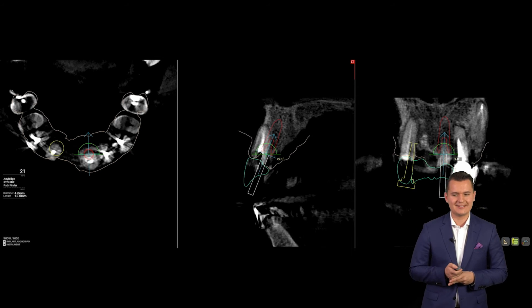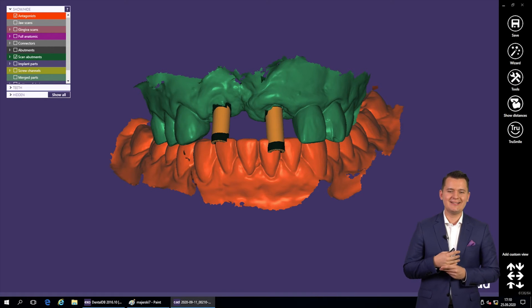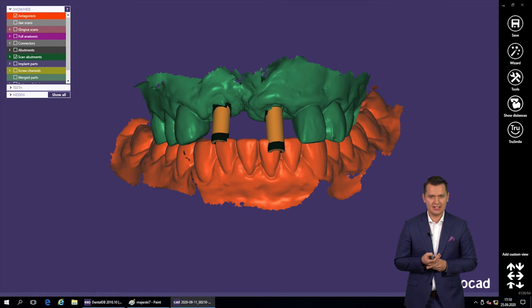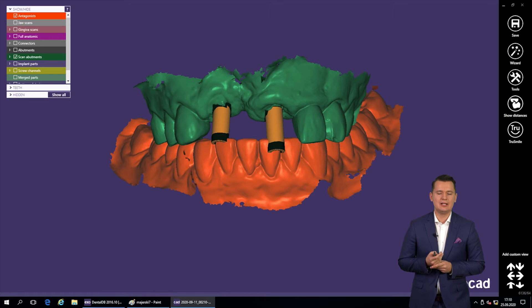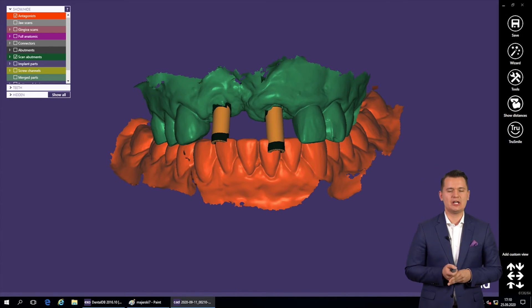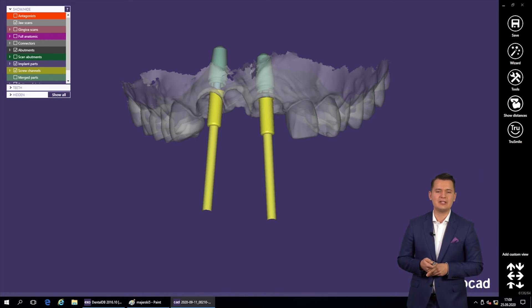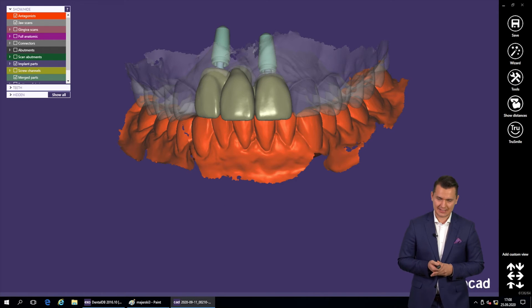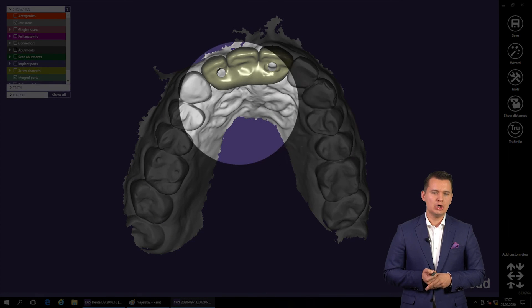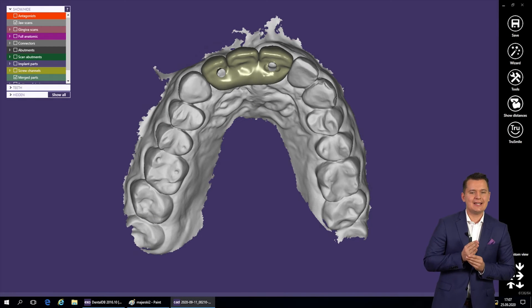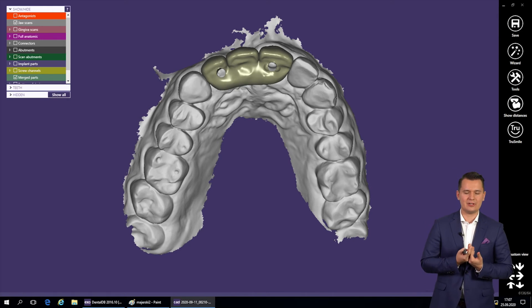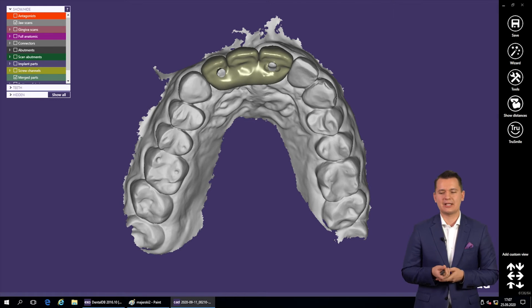We chose two long implants to get good primary stability — 13 mm implants. Then the same procedure: I created the STL file with digital scan bodies and sent it to my dental technician, who started planning the temporary restoration based on the wax-up. The restoration was made very thick to ensure success and prevent breakage during the next six to nine months of healing.